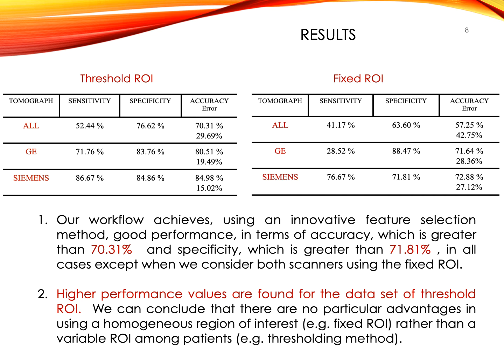Results show that our workflow achieves good performance in terms of accuracy, which is greater than 70.31%, and specificity, which is greater than 71.81%, in all cases except when we consider both scanners that use fixed region of interest.